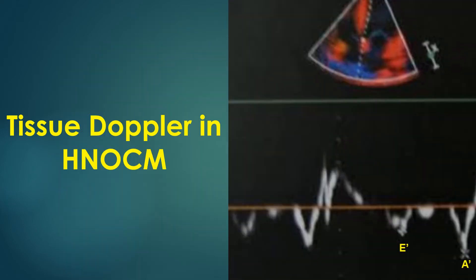Tissue Doppler imaging in hypertrophic non-obstructive cardiomyopathy shows a pattern suggestive of left ventricular diastolic dysfunction. A' during atrial systole is of higher amplitude than E' during early diastole. Normally, E' is of higher amplitude than A'. The upper panel shows the color 2D image from the apical 4-chamber view, confirming that TDI sampling is from the medial or septal mitral annulus.